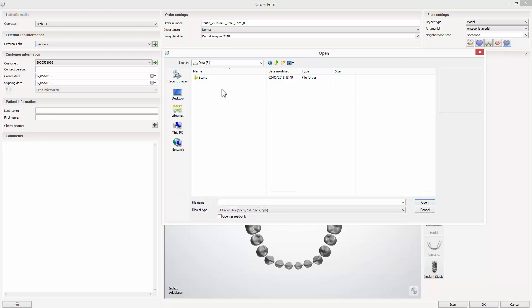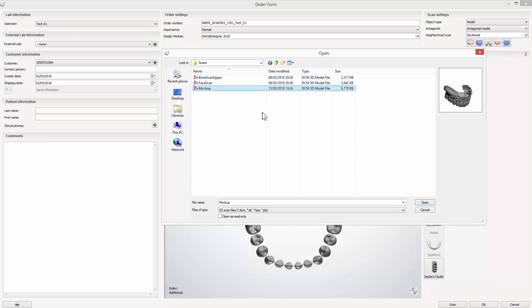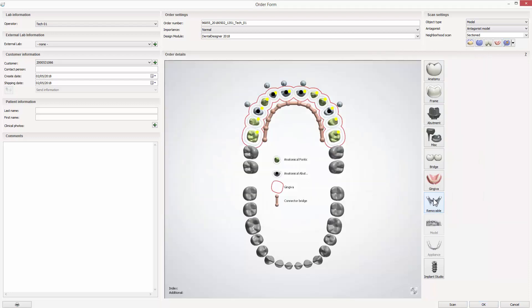Please select the scan you want to import and proceed by clicking the Open button. Notice that after choosing the scans, a drop-down list will appear near the icon. You can rename your scans or delete them from the order.